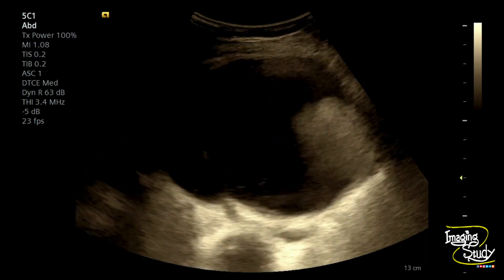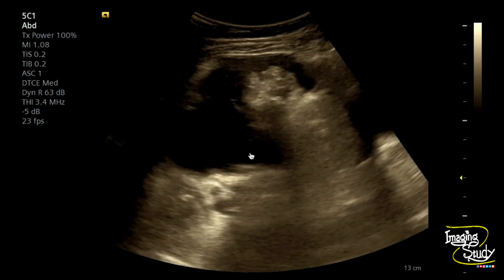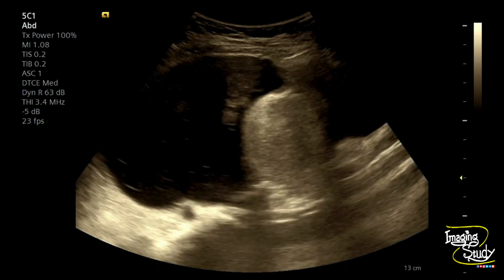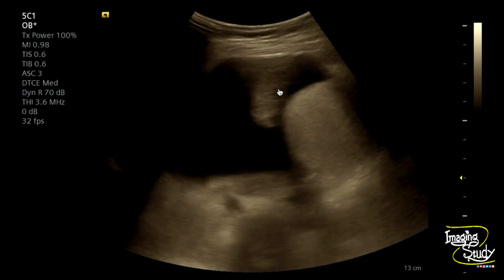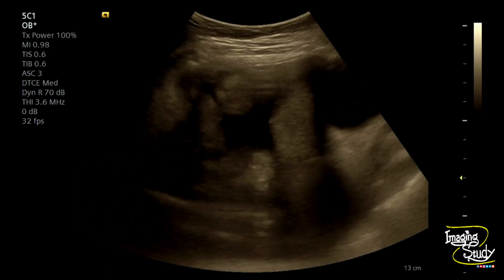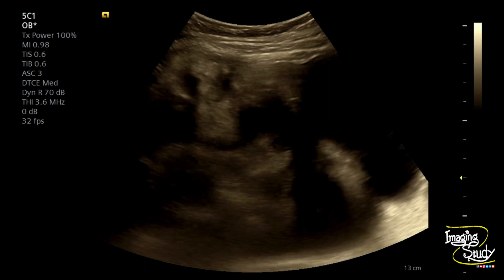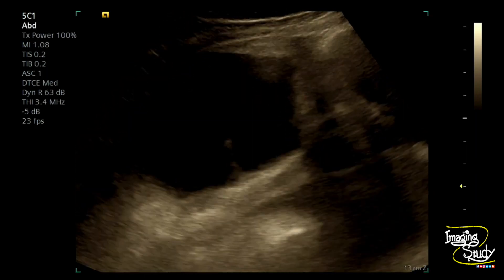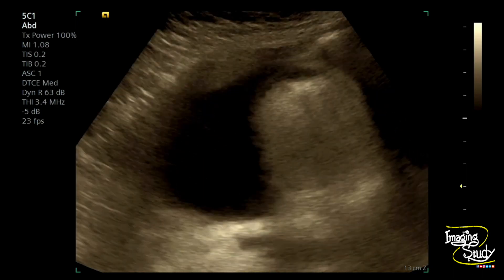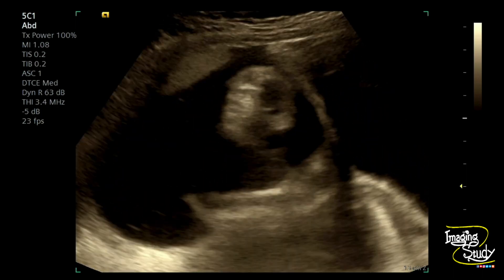Here you can also see a solid part containing a cystic area within it — this is actually the ovarian stroma containing small follicles, indicating the lesion is originating from the left ovary. The lesion was quite large, extending towards the right side of the patient below the umbilical region. This type of large lesion is always at risk of torsion.